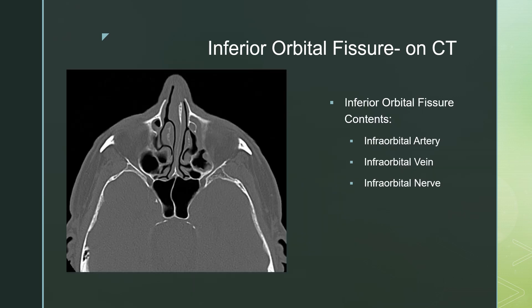The inferior orbital fissure contains the infraorbital artery, nerve, and vein. This is a little bit harder to see on CT imaging. You're basically looking at the inferior aspect of the orbit and looking for the canal transmitting that infraorbital nerve, artery, and vein. You can see this opening right here along the sphenoid, and here are the ethmoids — this is the inferior orbital fissure extending towards the infraorbital canal, which you would see below the orbit itself.